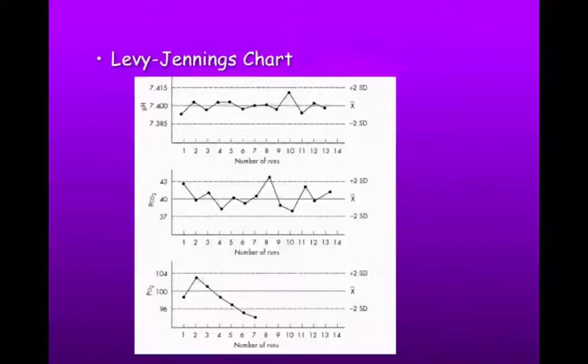And then if we look at run number 8, it exceeds the +2 standard deviation. That means that if it exceeds it, it's something that you need to address. It's an outlier that needs to be addressed. It was out of control on that particular run. So that means either you need to recalibrate the machine, you need to look and figure out why it was out of calibration, and then rerun that control before you run any actual blood gases on the machine.